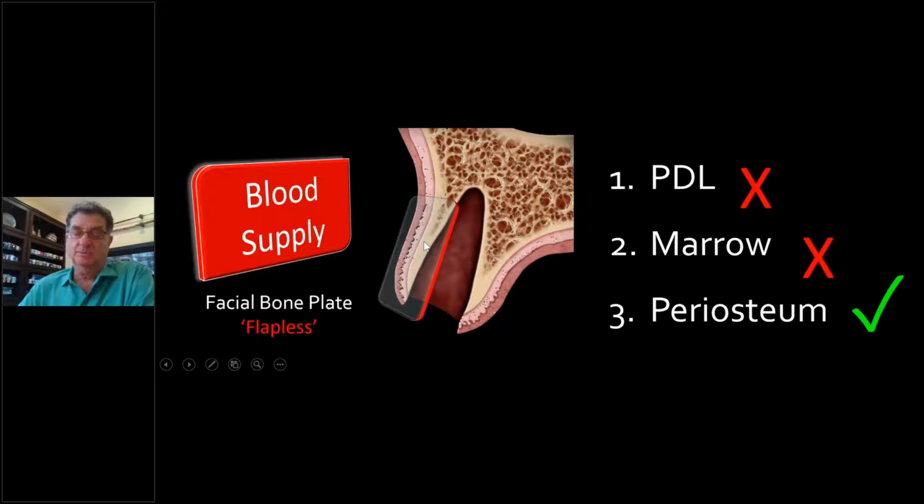So the last thing I want to do is lift up that periosteum, if it's there, and start to decrease the blood supply to that piece of bone. A lot of people do that and put in connective tissues and everything, even if the buccal plate is there. But I really feel that you should try to minimize that, as you will see. Try to simplify the surgery, especially if the buccal plate is there.